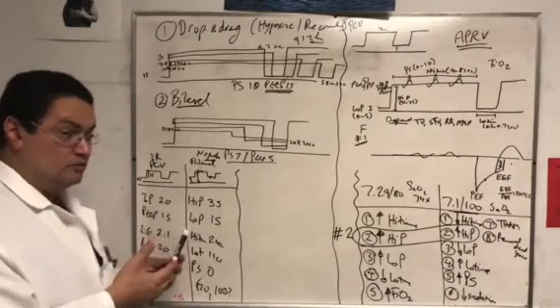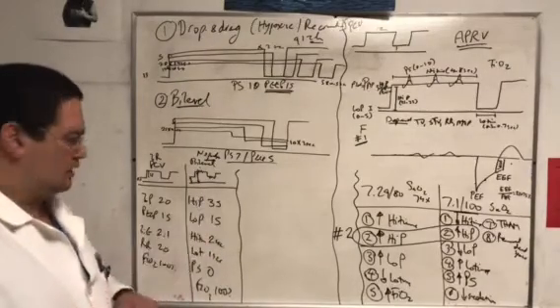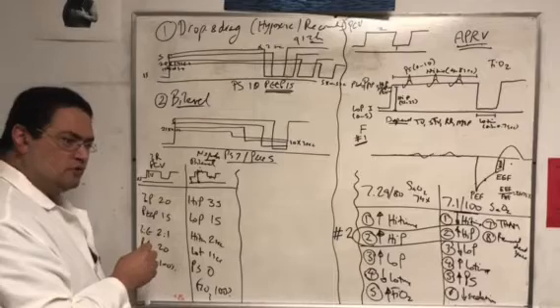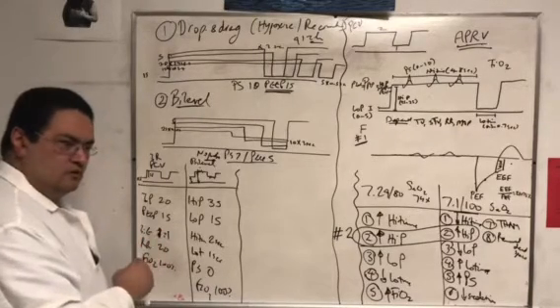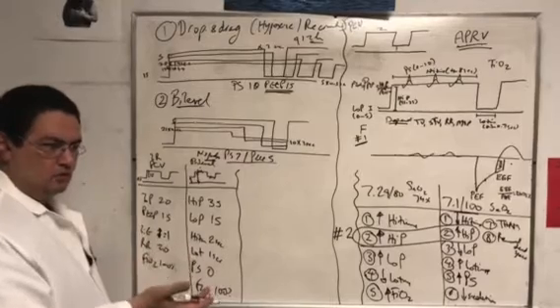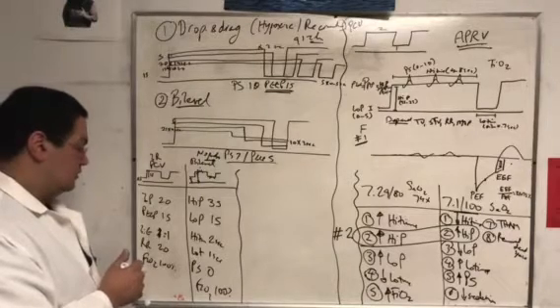So before we moved to this, we were a pressure control hospital. We were doing pressure control in the ICU all the time. And when we use pressure control, we typically put the patient on 1-to-1 I-to-E ratio. We don't do 2-to-1 obviously because we don't need to paralyze everybody. 1-to-1 they can tolerate without paralysis, and it's good recruitment still, right?